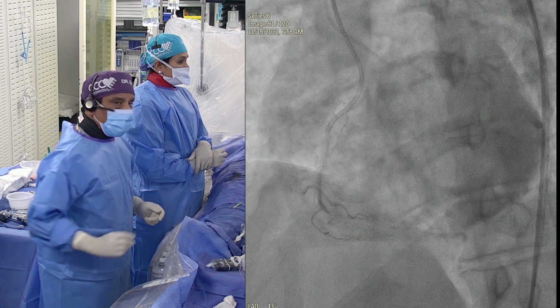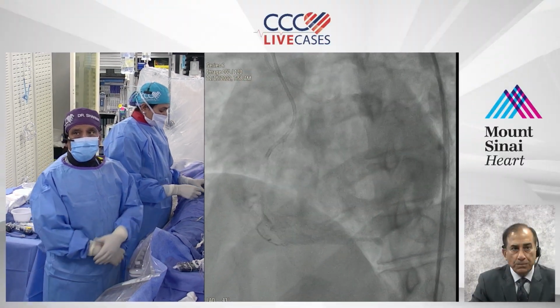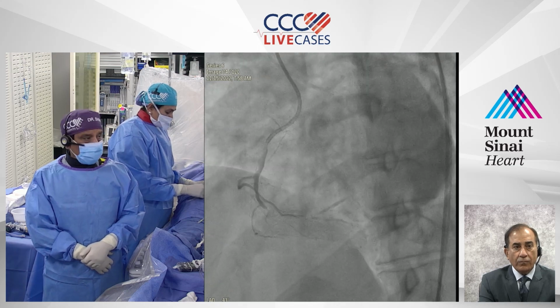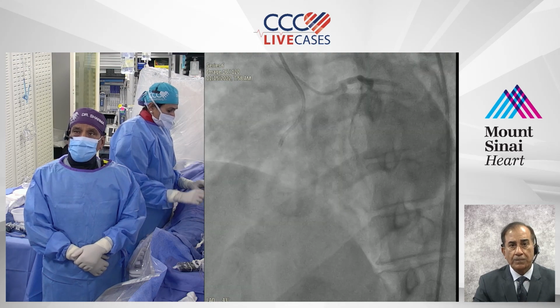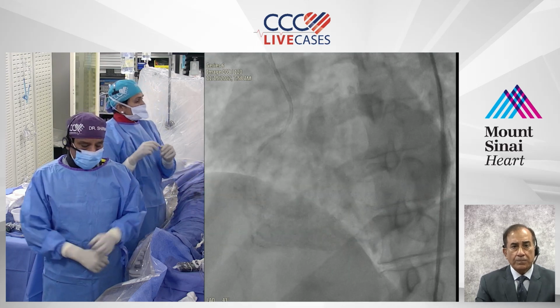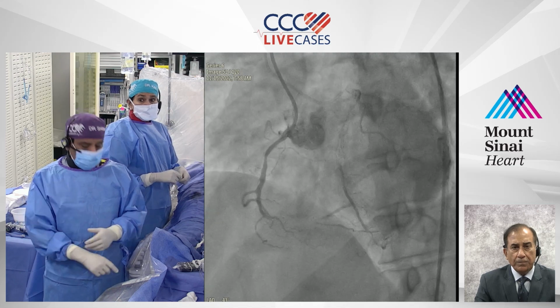So as you know, Samir, significantly without much calcification. Yeah, that is true. Young person, no diabetes. Particularly no renal failure issues. So all were soft lesions. Even the circumflex was soft when intervention was done. No atherectomy or atherotomy was needed when PCI was done of the LAD, ramus, OM, and distal circ. So here also, no calcium.